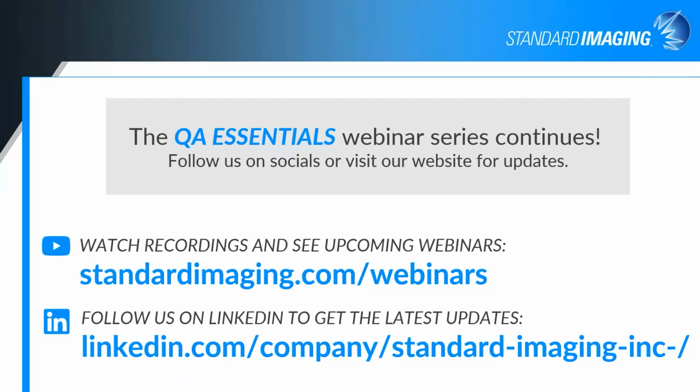And the W1 is listed in that publication with kQ of 1, unity in all of those tables. The W2 is identical. The fiber is identical to the W1. And actually, if you buy a W2, you get a package that has both the 1x1 fiber, that is the fine resolution tip, and a 1x3 millimeter tip that exactly matches the W1 fibers.